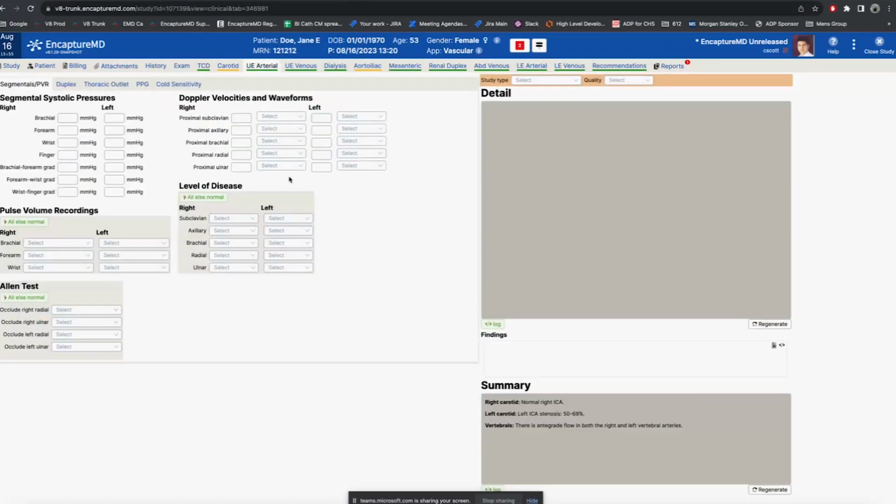The upper extremity arterial study has a couple of different methods that can be used. One is segmental pressures. It's essentially looking at blood pressures using blood pressure cuffs in various places along the arm. You can put one in the forearm, or wherever you need to put them, and then measure the blood pressure using either pulsations or, most likely, some kind of non-imaging transducer to pick up when the velocities begin and end, and then look at the pressure cuffs to know what the pressures are in that area. That's all given in millimeters of mercury.